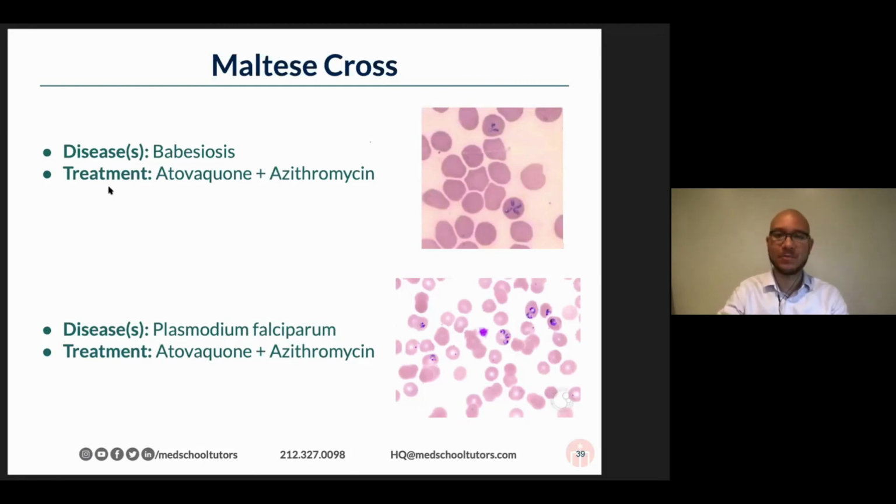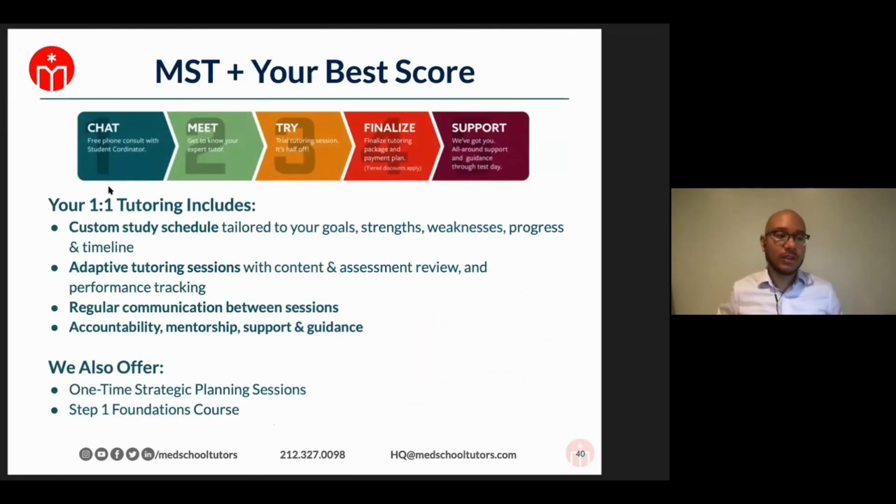Excellent. Okay, so I just wanted to wrap up by, first of all, congratulating all of you, future hematologists and colleagues of mine. I hope you're all excited to look at peripheral blood smears, just as excited as I am. And the take-home lessons here from a big picture perspective is, if the image helps you to clinch that diagnosis, like in hairy cell leukemia, there's basically nothing else it can be. It can help you tremendously. If you aren't sure what it is, have no fear.